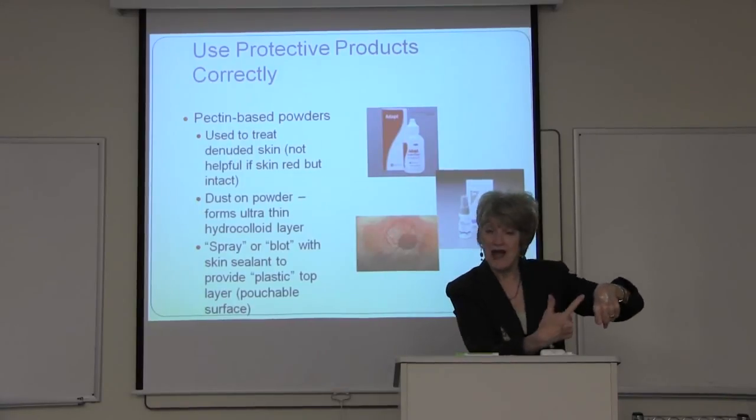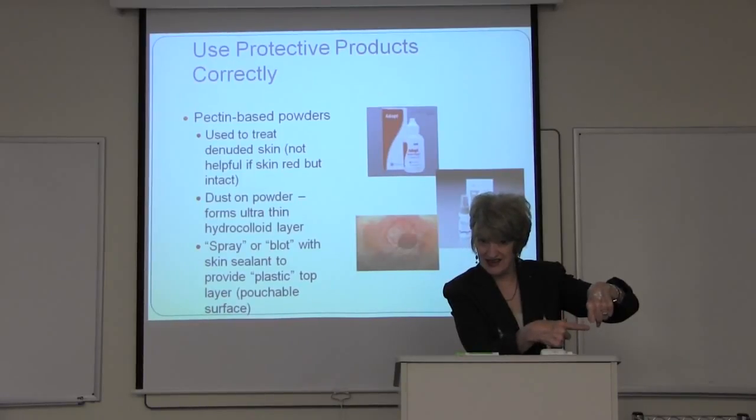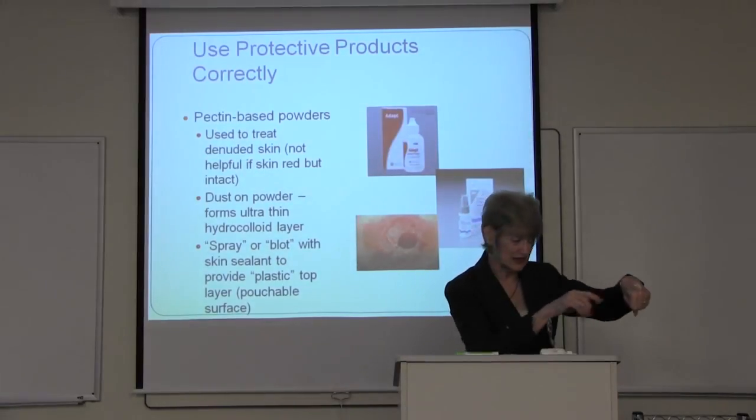However, the pouch won't stick to the powder. So that's why we use the technique called crusting. So first we put down the powder, it interacts with the damaged skin to form a gummy protective layer.